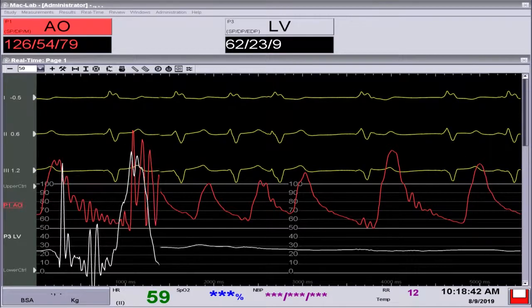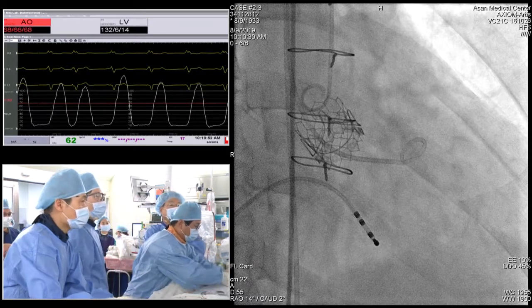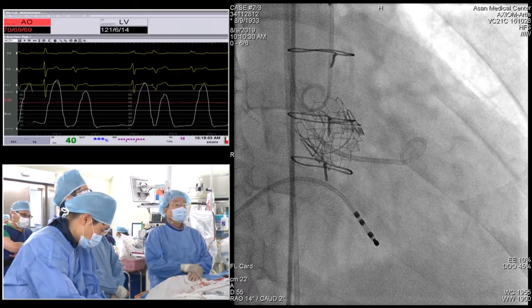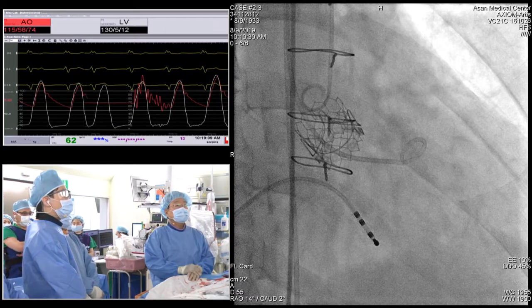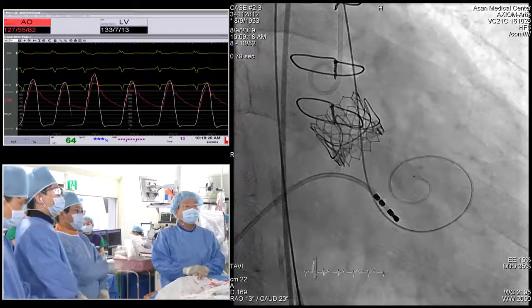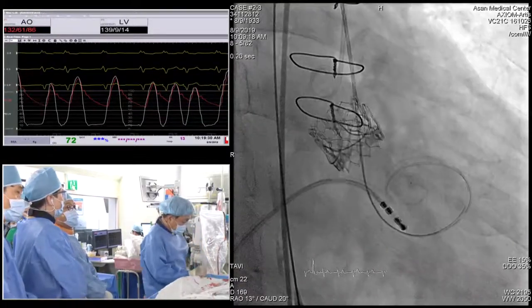Diastolic is good. Do you see the hemodynamics, Eberhard? Yeah, in echocardiography, yes. The LVDP, which was about 25 or so, is now 12. Peak pressure gradient of 15 millimeters. No significant gradient on echo. Should we check the AR now? Could you show us that? Simultaneous pressure: a very, very small, trivial gradient, maybe less than 5. The diastolic looks fantastic, almost normalized. How is the echo now? No trace AR. No AR.